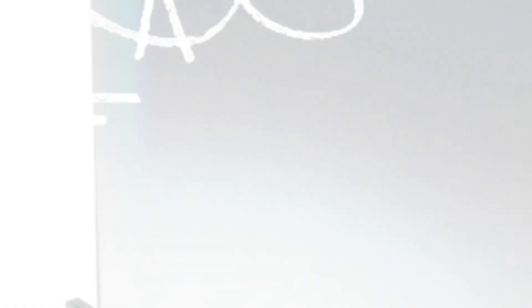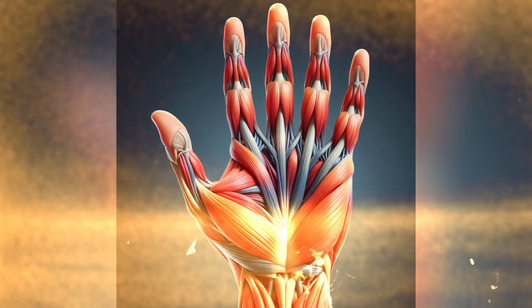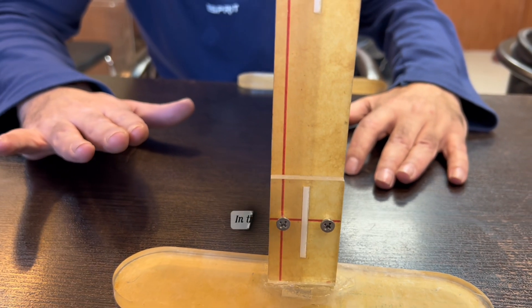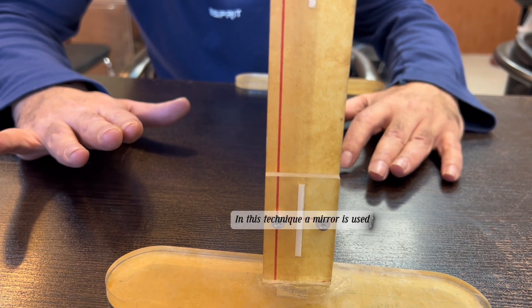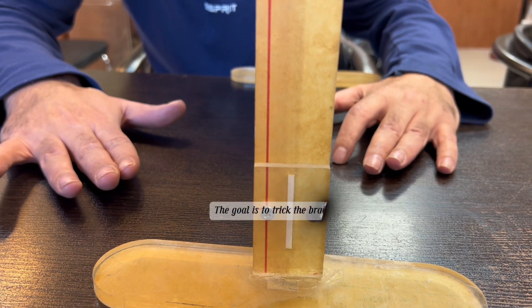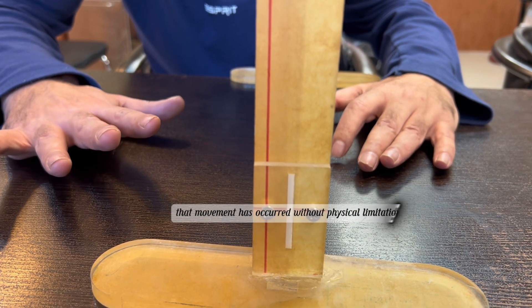We need a mirror, and ready-made samples are available in the market. Mirror therapy is one of the effective techniques in improving daily life activities. In this technique, a mirror is used to create a reflective illusion of an affected limb. The goal is to trick the brain into thinking that movement has occurred without physical limitations.